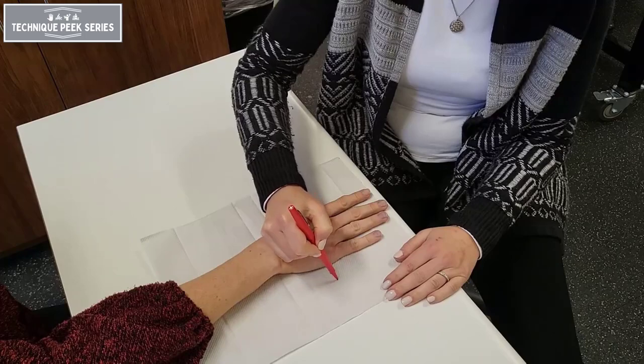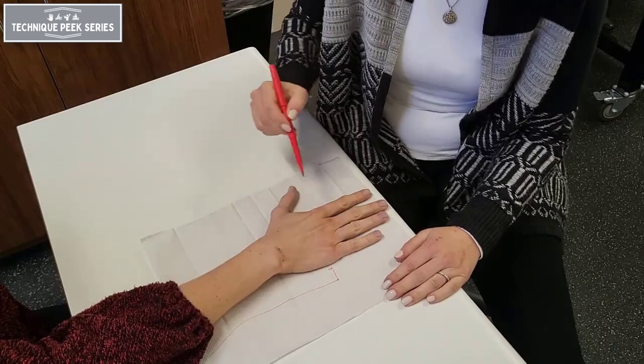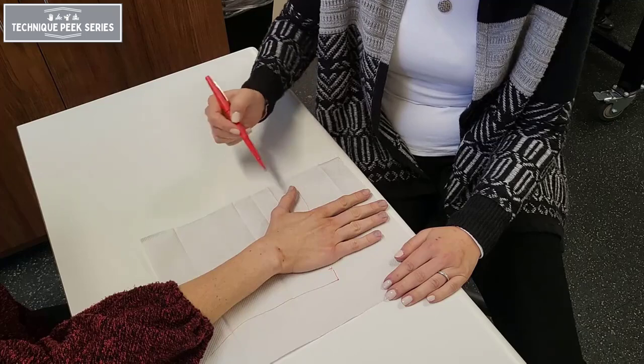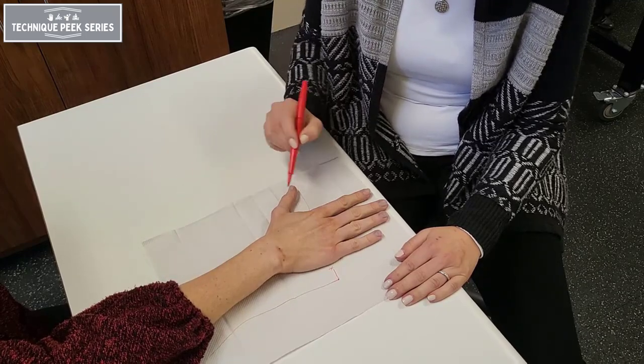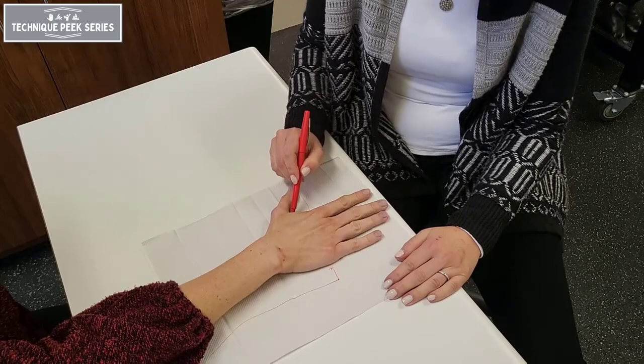To complete the pattern, connect the line from the distal palmar crease downward two-thirds the length of the forearm. Angle your pen slightly outward to create enough depth for the forearm. Also mark the web space of the thumb.